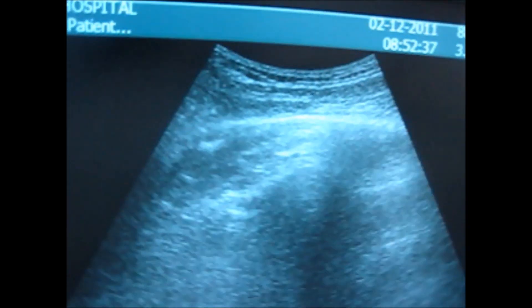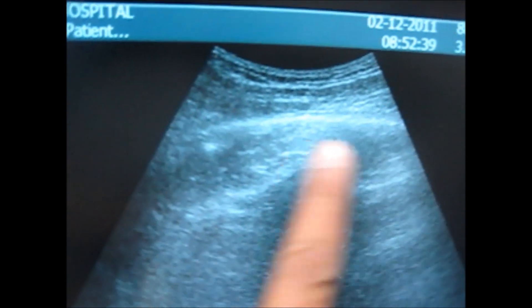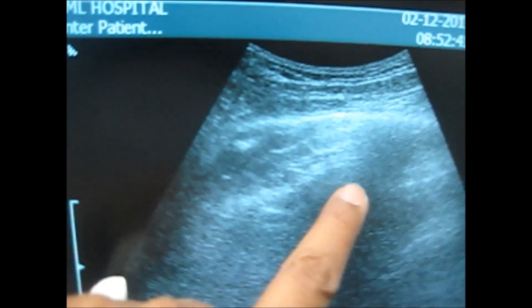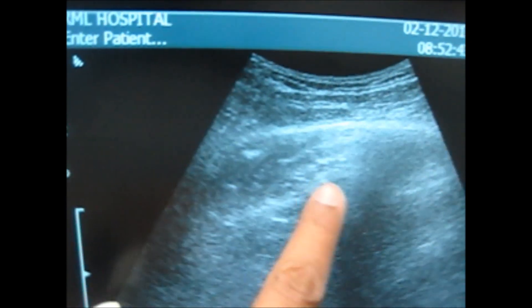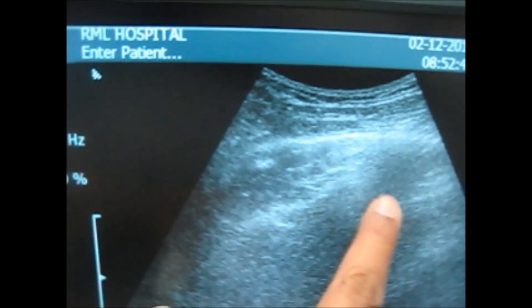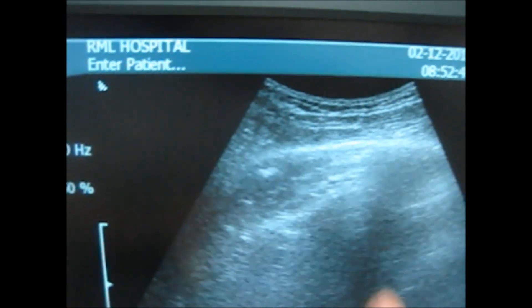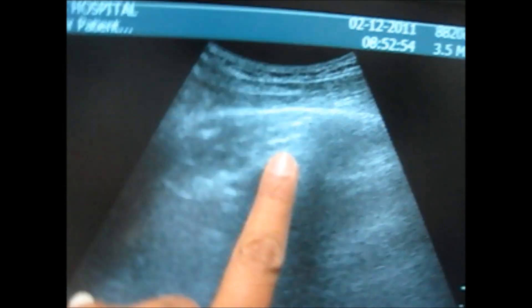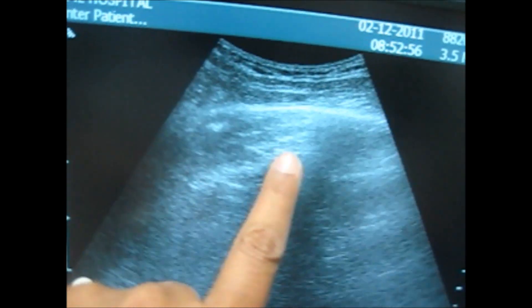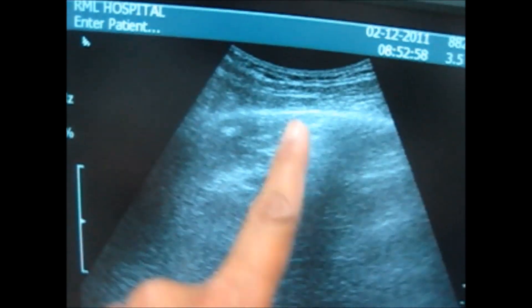For the thorax view, you have to look at the 3rd and 4th intercostal space in the mid-clavicular line. These are the two ribs that define that intercostal space.